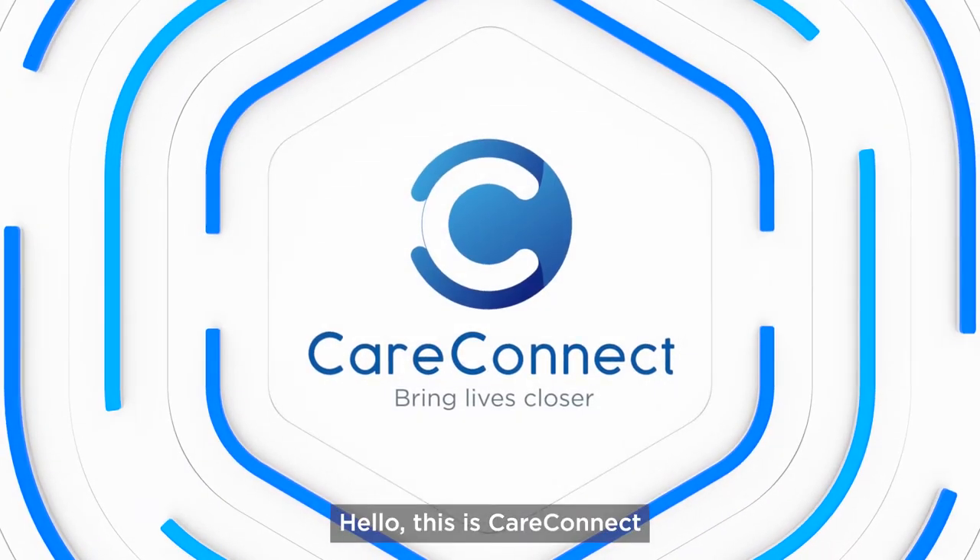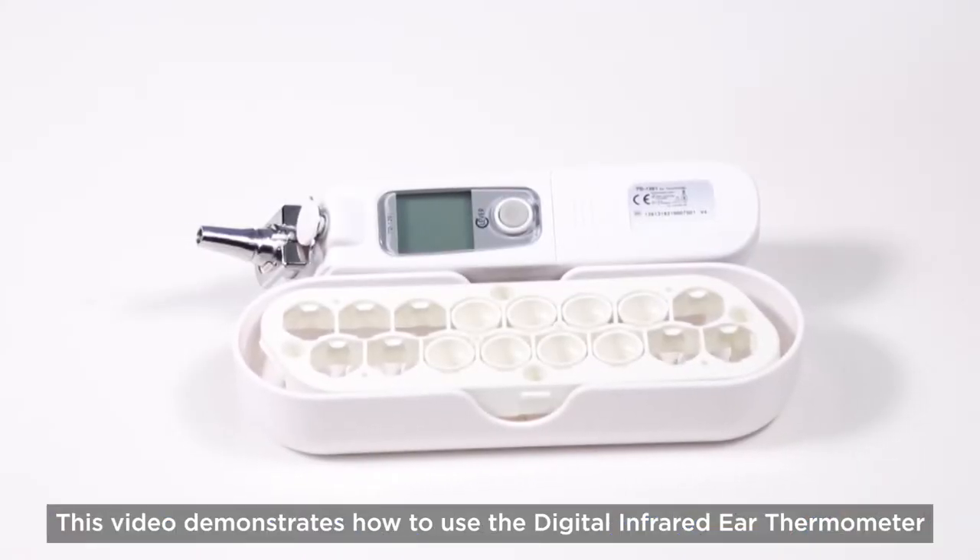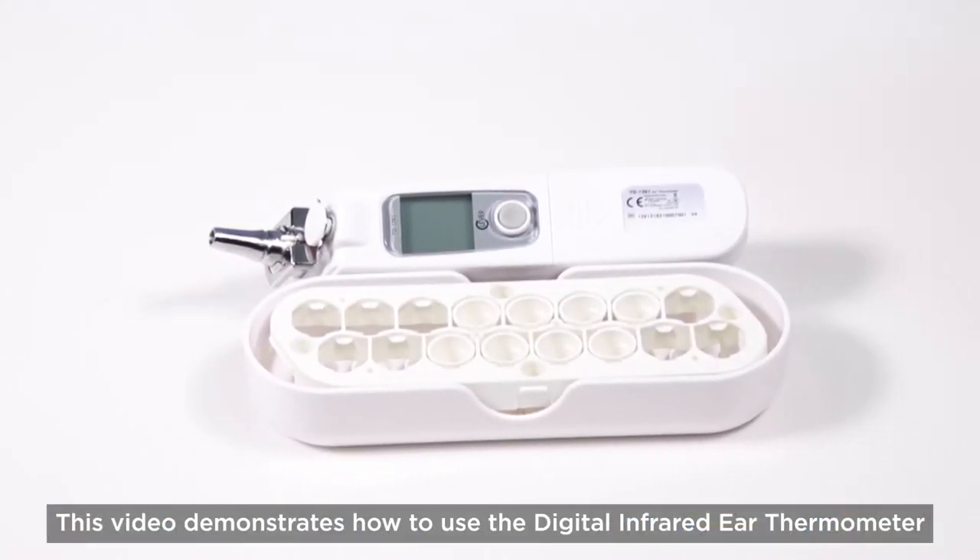Hello, this is CareConnect. This video demonstrates how to use the Digital Infrared Ear Thermometer.